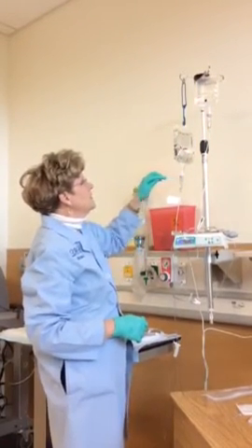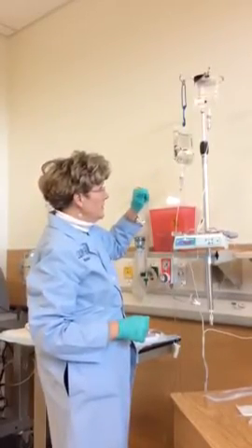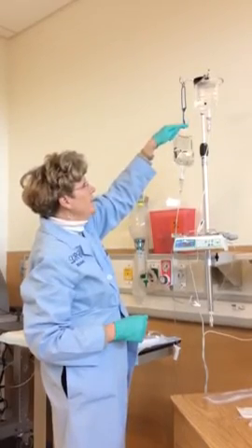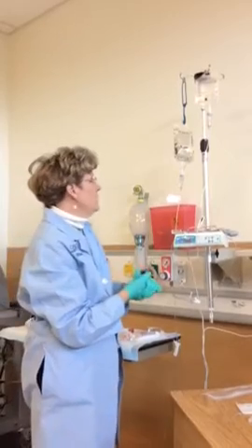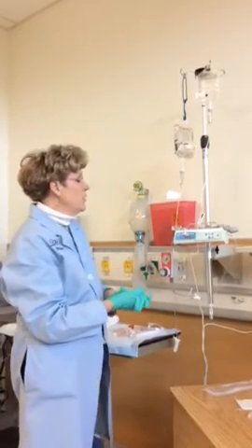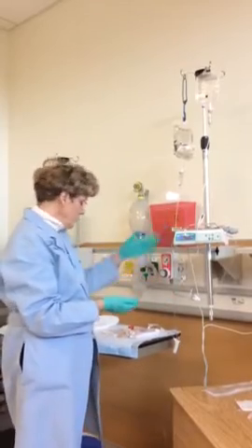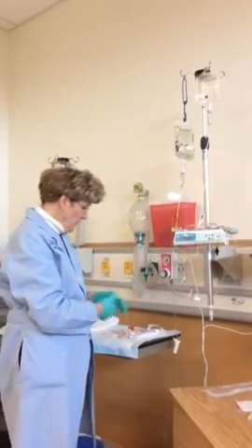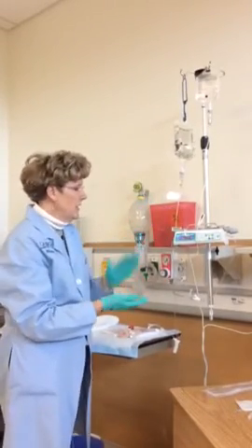This one is stopped. And here it comes. There it is. And now that piggyback is dripping. So that's the most important thing to make sure that you actually run in your antibiotic. All right. So when this is complete, we would go ahead and shut down the pump, and we would remove the primary tubing, flush our intermittent device, make sure that you've got a sterile cap on the end of that tubing, and put it away until the next IV is due. And that's it.